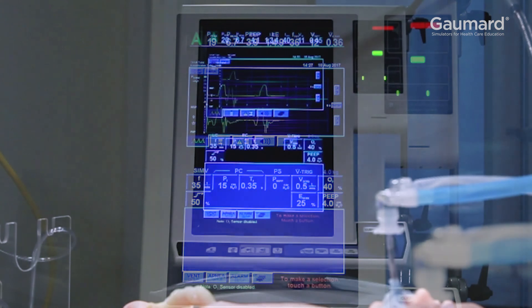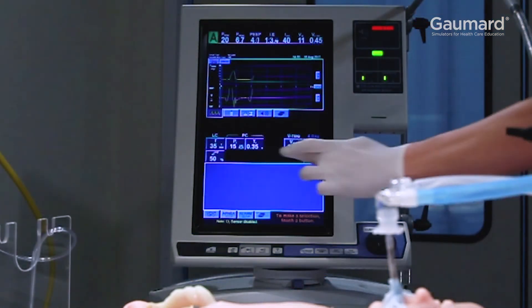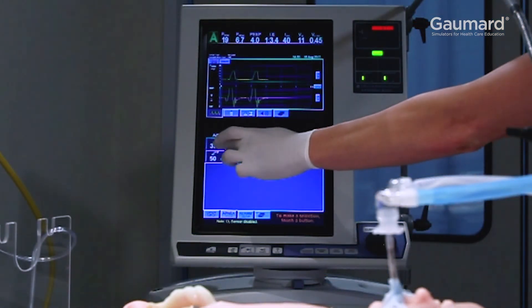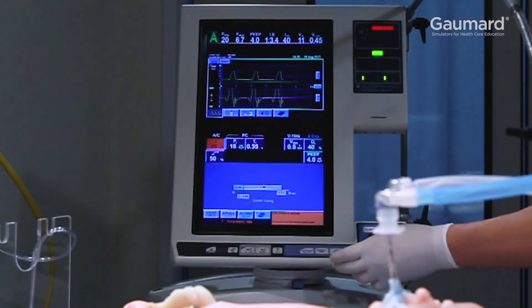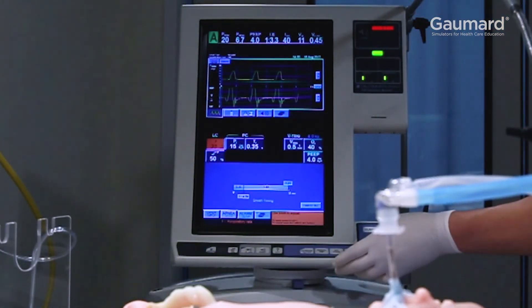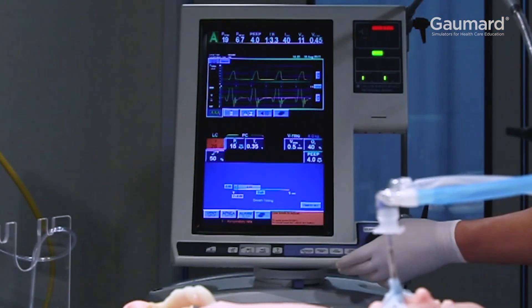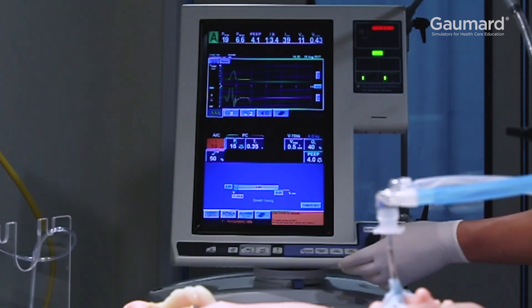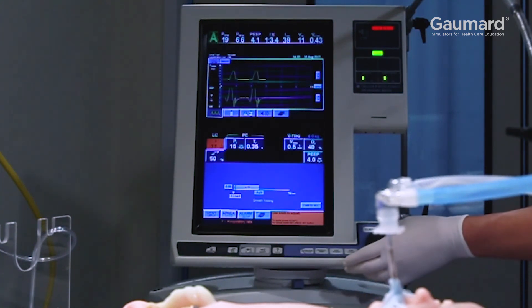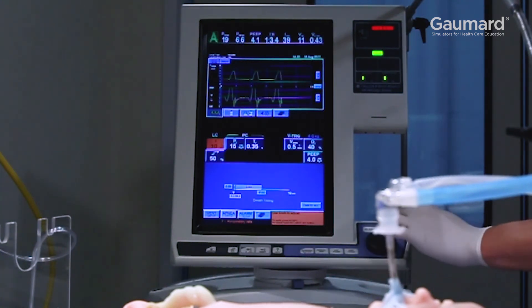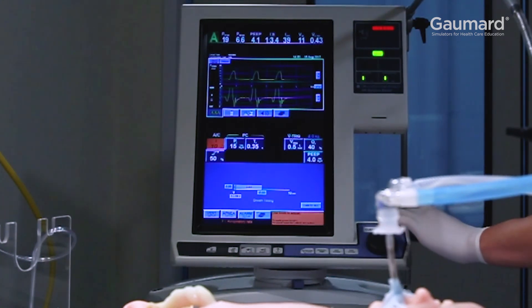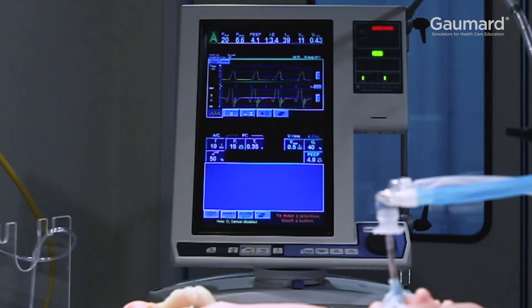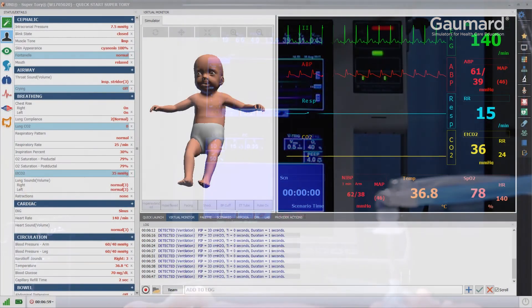When the ventilation rate falls below 15 breaths per minute, as in the case with spontaneous breathing trials and weaning protocols, SuperTori shows an automatic respiratory drive and will begin breathing spontaneously at the rate and pattern specified in the UNI software.